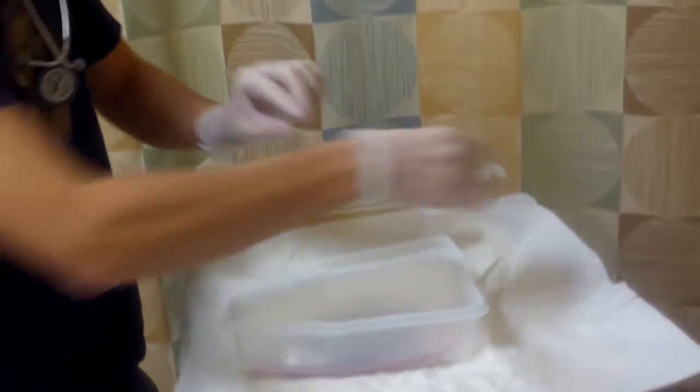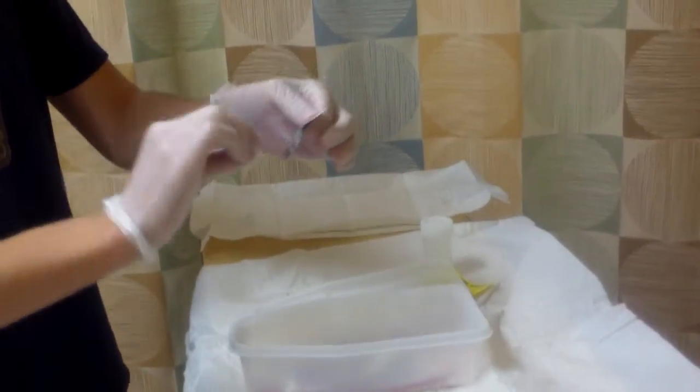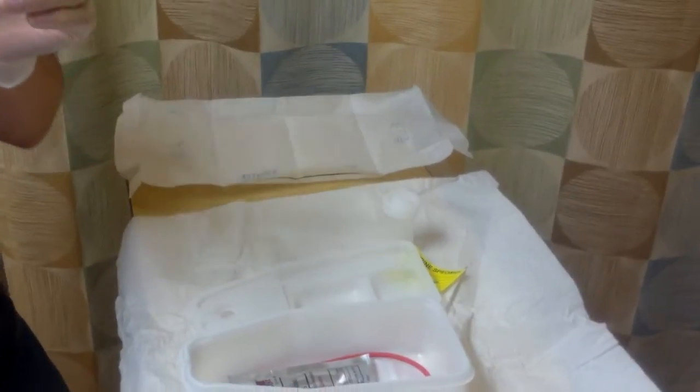Then I'm going to open my tray up on the side, and keep my specimen container here with the specimen label. And then I'm going to take my lubricant. I'm going to open it up. I'm going to pour it in the tray like that. Then we'll get that ready.